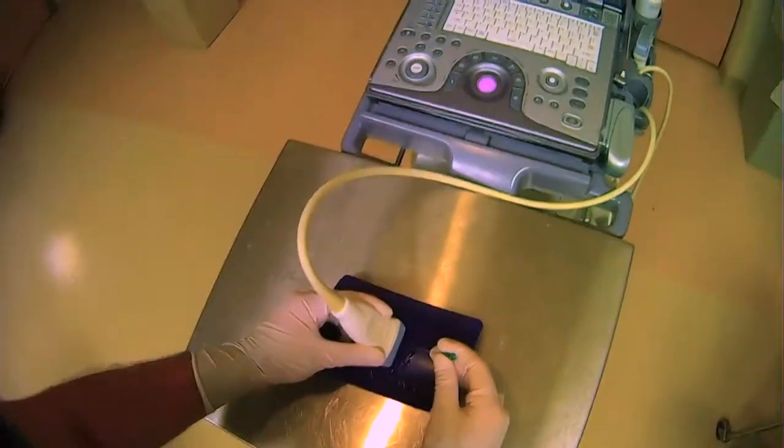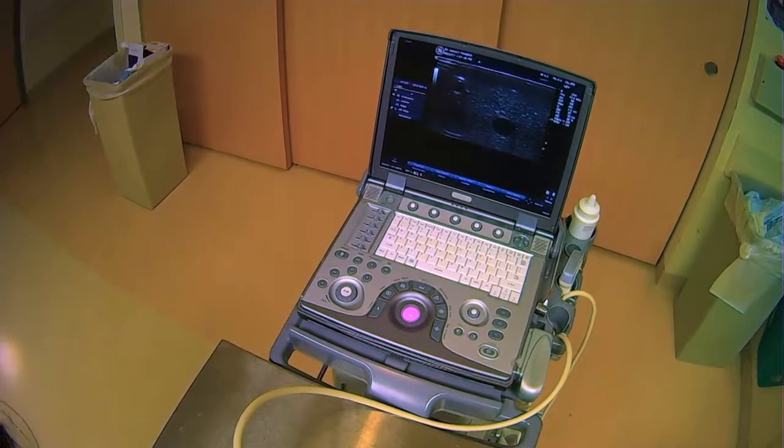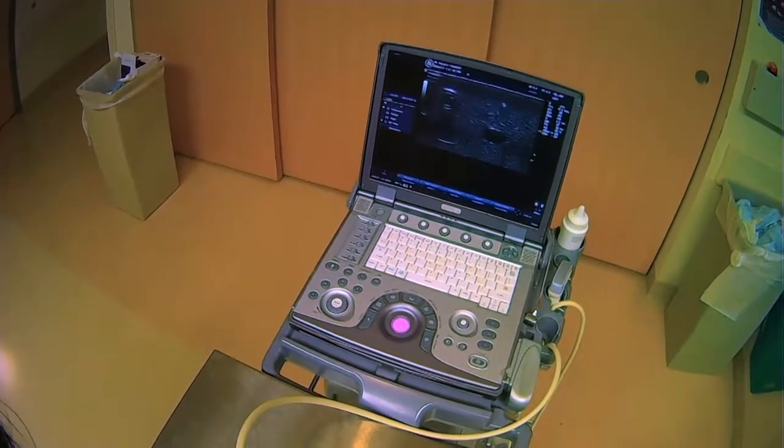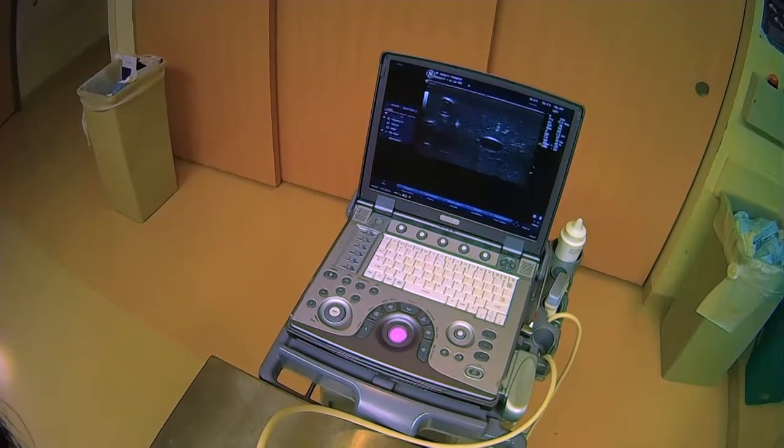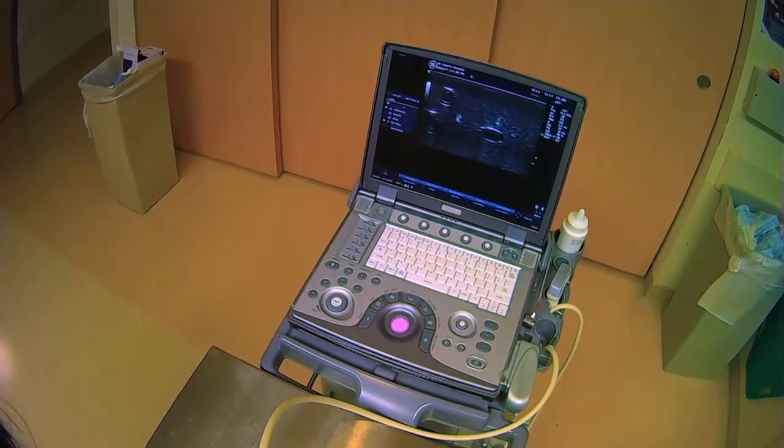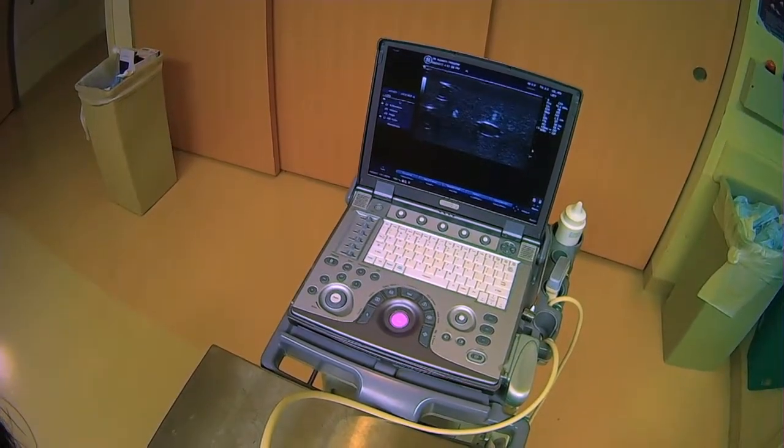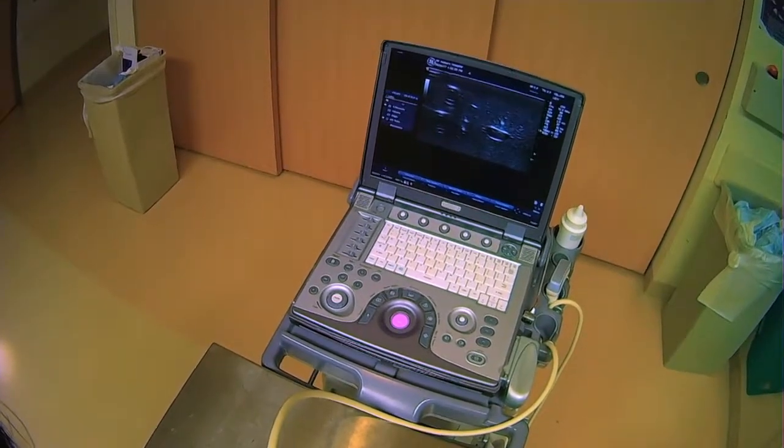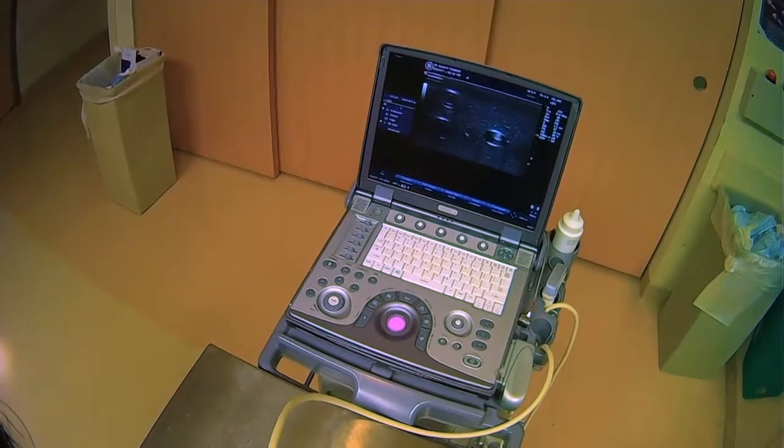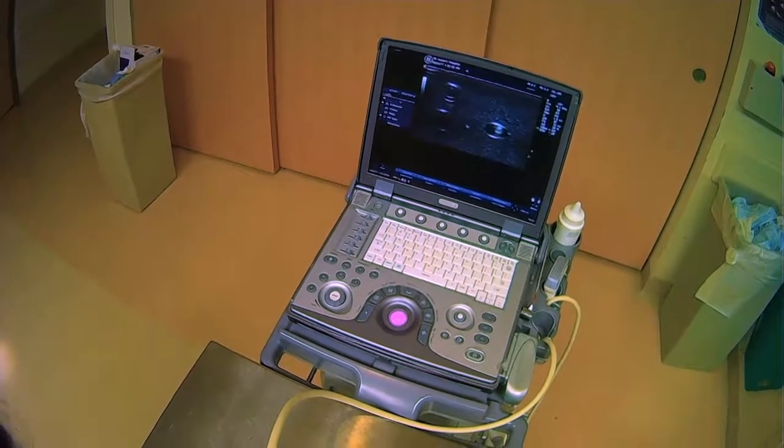So again we can see my needle tip right there but as I begin inserting it I have to follow it with my ultrasound probe by steepening its angle until I get into the vessel and I go inside and I track my tip.